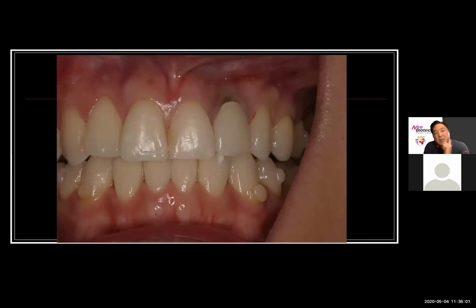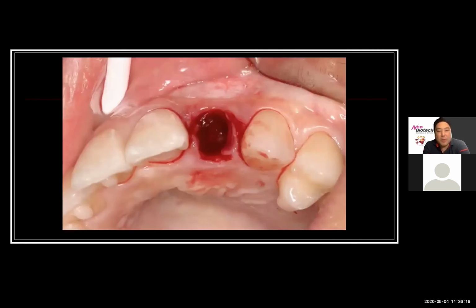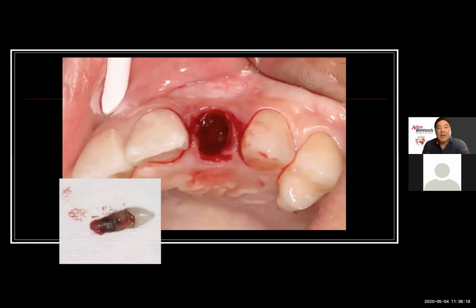the year. So this was the case not for immediate implant placement, but to be more predictable and safe and less risk prone, we were going to stage this case with bone graft and then come back for implant placement. So here's the tooth removed, extracted, and now you can see the architecture of the hard tissue outline of how the soft tissue outline presents to us. And by looking at this concavity here, this really shows you the amount of deficiency that's probably present underneath the soft tissue. And just by the thin biotype is telling us a lot.